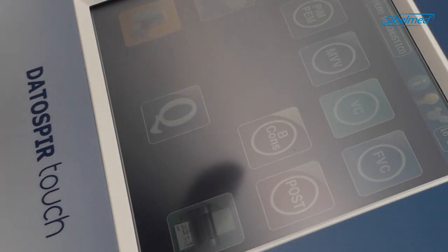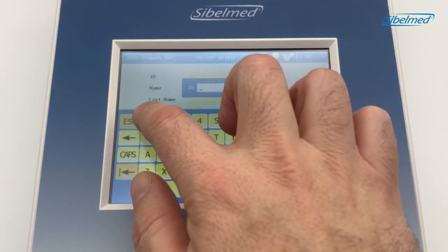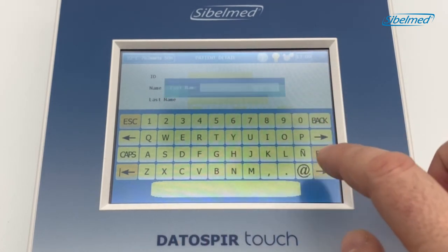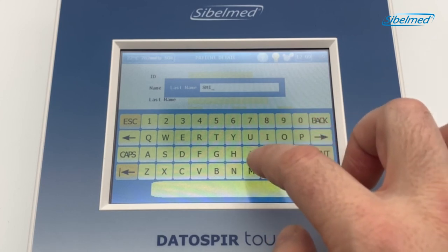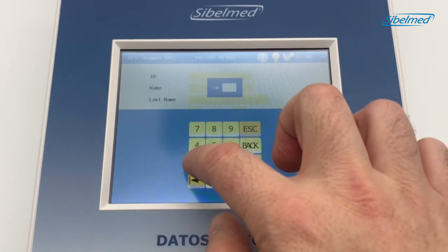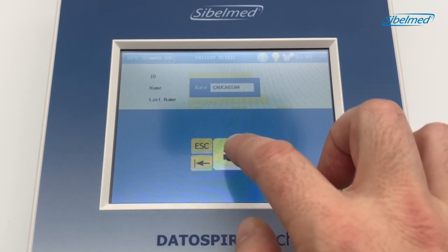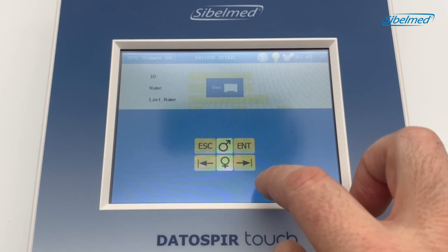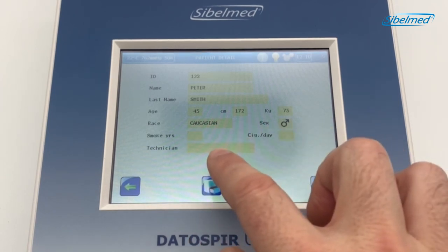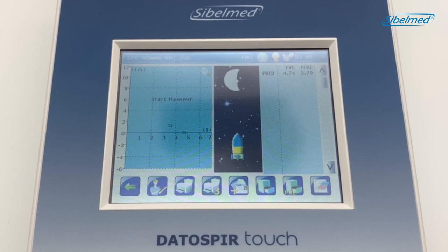To start a forced spirometry test, we will press the FVC icon. We will click on the ID field to fill out the patient's data. A QWERTY keyboard will come up and we will enter the patient data one by one: the name, the surname, the age, the height, the weight, and the ethnic factor. This data is very important because it will be compared with normal values. Once everything is correct, we can accept.